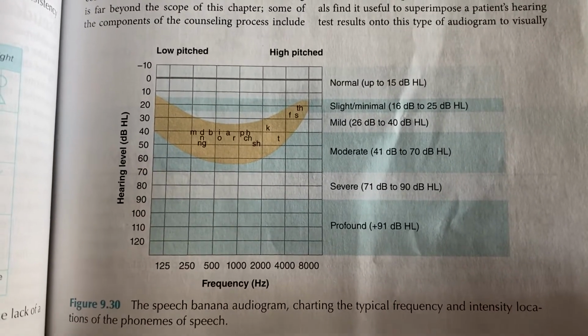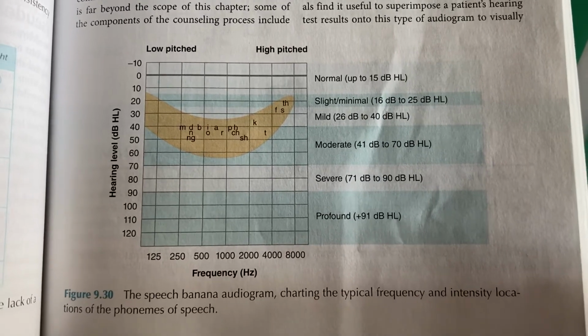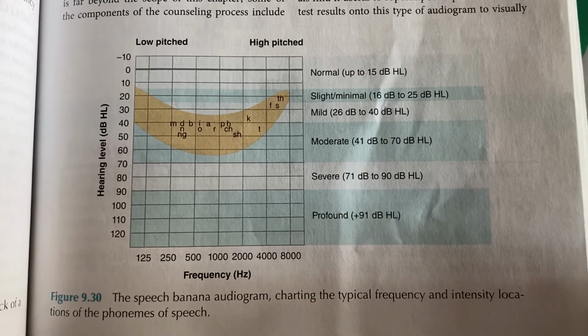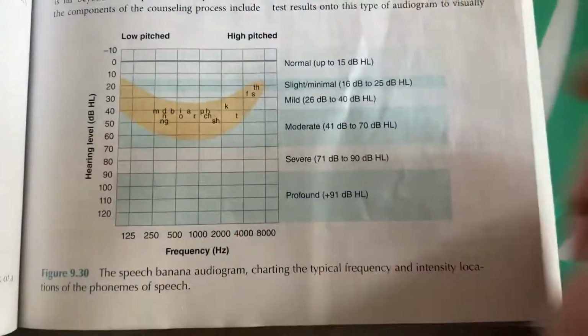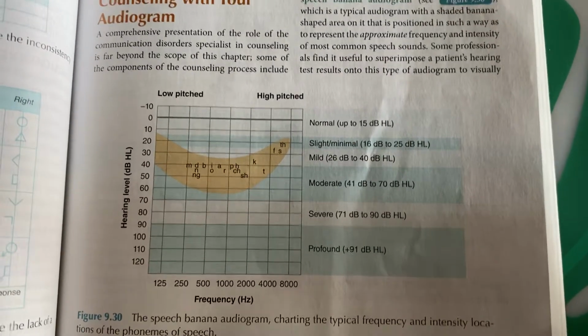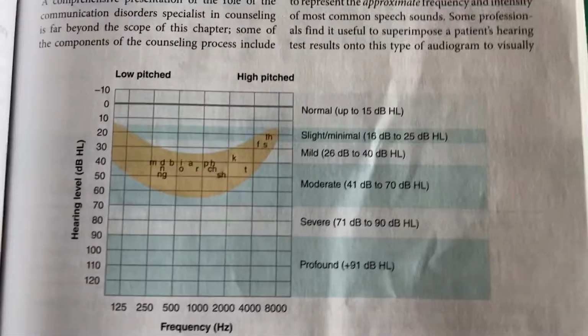All right, class, we are on to the second part of the acoustics mini lesson here. What you see in front of you is what's called an audiogram. This graph right here is basically what I use on a daily basis to diagnose people's hearing loss. Now, this is on page 171 in the textbook if you wanted to follow along.